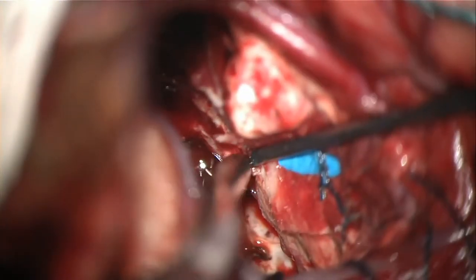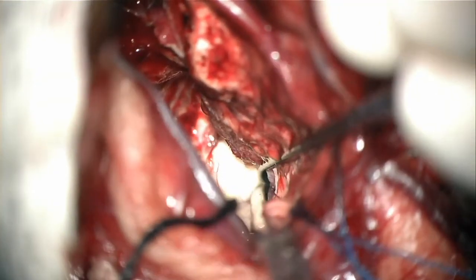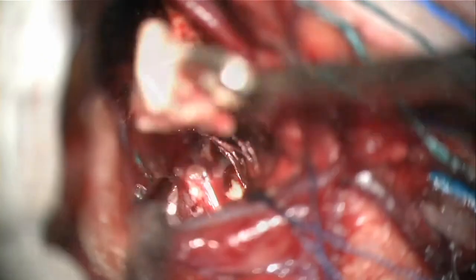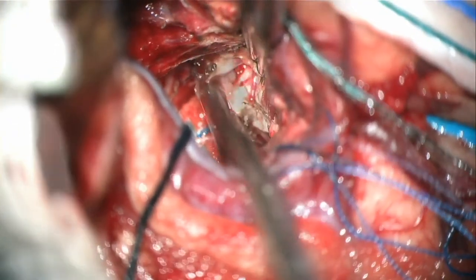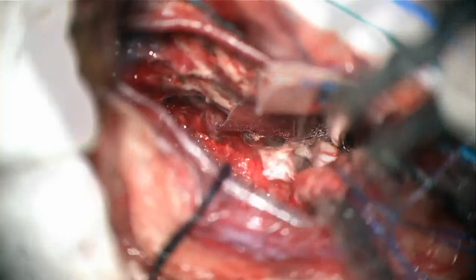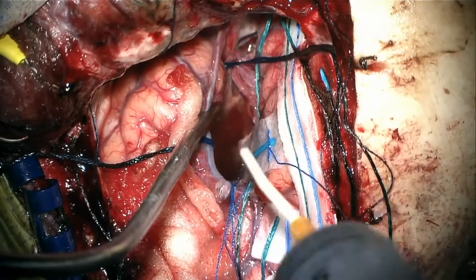I continue dissecting the hippocampus from the ventricle towards the choroid plexus, and I mobilize this until I find the choroid plexus located medially, and I remove this in a piecemeal fashion. This is the choroid plexus and some of the remaining tumor attached to it. This choroid plexus forms my medial aspect of the resection; that is the atrium we are seeing back there, and that is the tail of the hippocampus that I cannot reach through this approach.